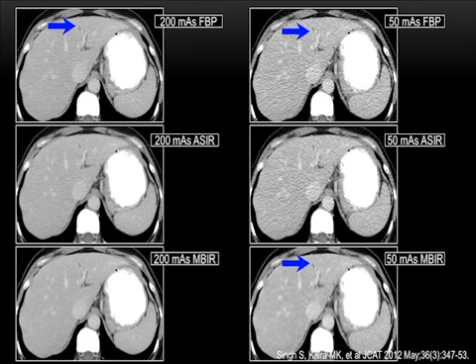So now there are different terms used to point out this texture, which is a different look: a plasticky look, a blotchy look, or they'll just call it a different look, even though I see the noise. If you ask a specific question, is the noise gone down? Yes, noise has gone down. Can you see a tiny lesion? I can still detect a tiny lesion, but we cannot call it the same as this one. So I think that's where more work needs to be done with the IR: how do we optimize the algorithms to get the same image quality we were used to looking at.